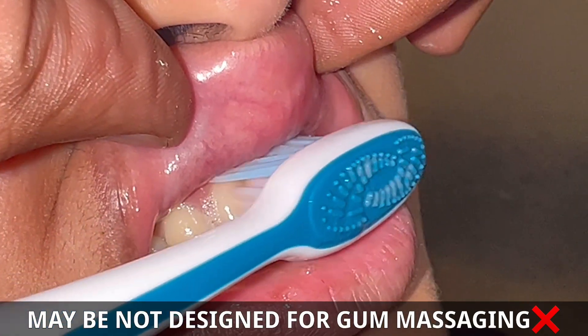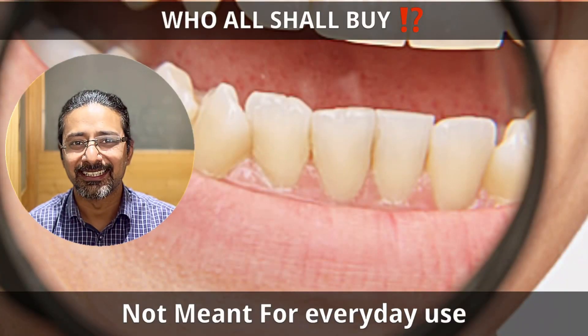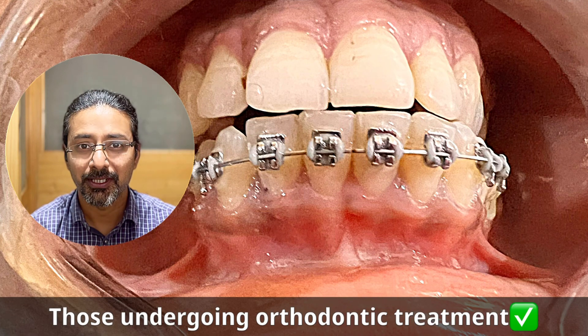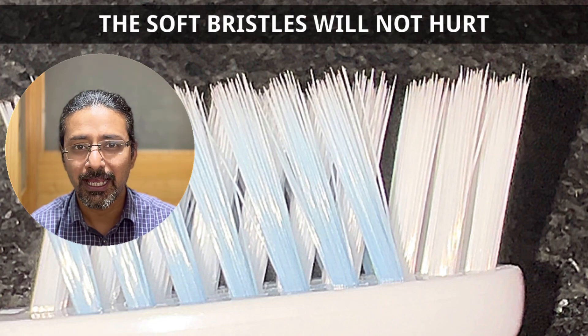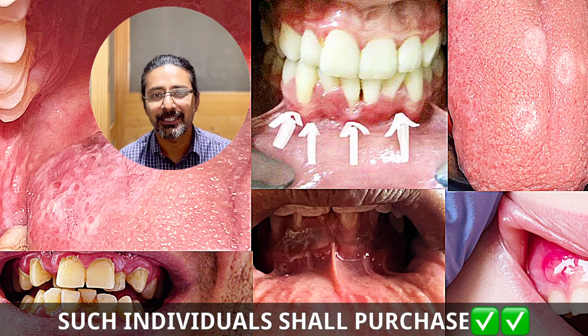Please make sure you do not attempt gum massaging at home at any cost — you might convert your healthy gums into bleeding gums. Are you planning to buy these? Listen to this first. All those who have undergone orthodontic treatment, or oral surgeries namely extractions, endodontic surgeries, or periodontal flap surgeries — these soft bristles will not hurt and will clean effectively. Individuals suffering from oral lesions, blisters, gingivitis, periodontitis, malignancies, sensitivity issues, or malocclusions where food accumulates in between teeth — these are the individuals who should buy these soft bristled toothbrushes.